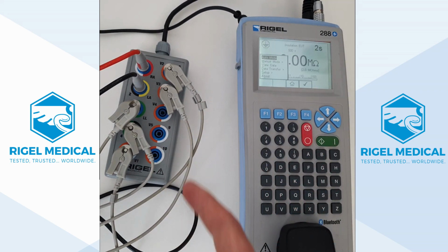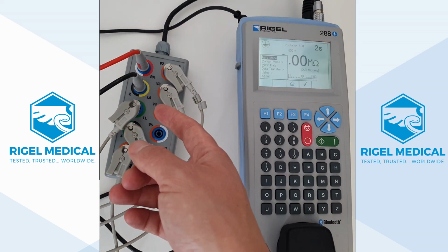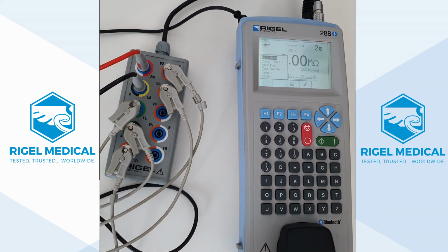So let's say our defib paddles are BF, defibrillator proof, and our ECG connections are CF, also defibrillator proof. However, in regards to safety testing, B, BF and CF are all that's relevant. The defib proof classification doesn't really apply.